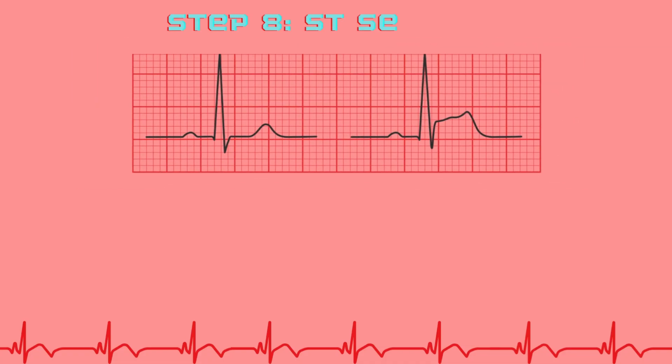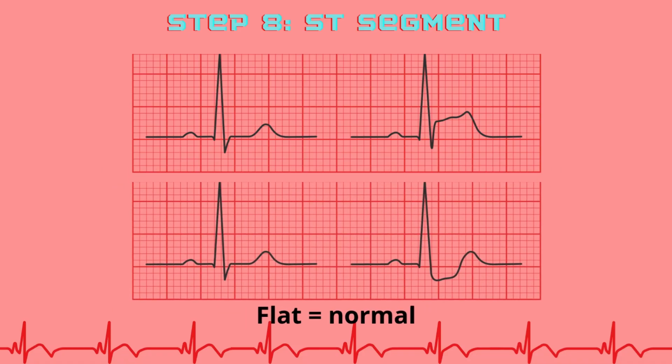Step 8 is the ST segment. Is it elevated, depressed or flat? Localize any ST changes to coronary territories. And remember, elevation more than 1 mm may suggest acute injury.